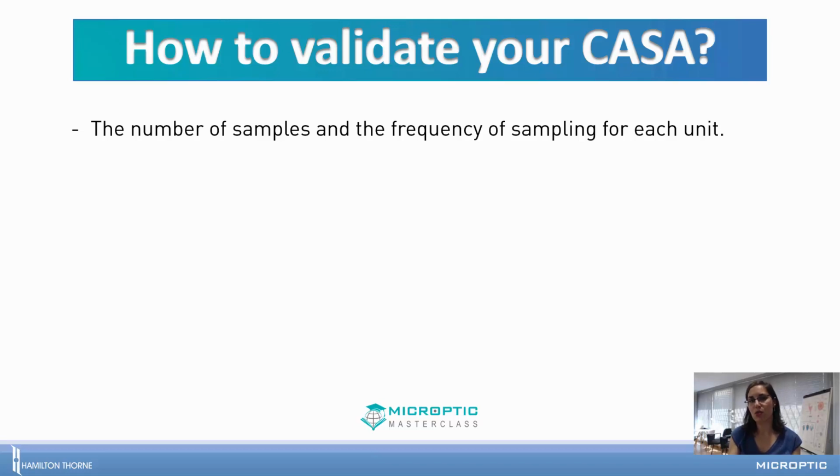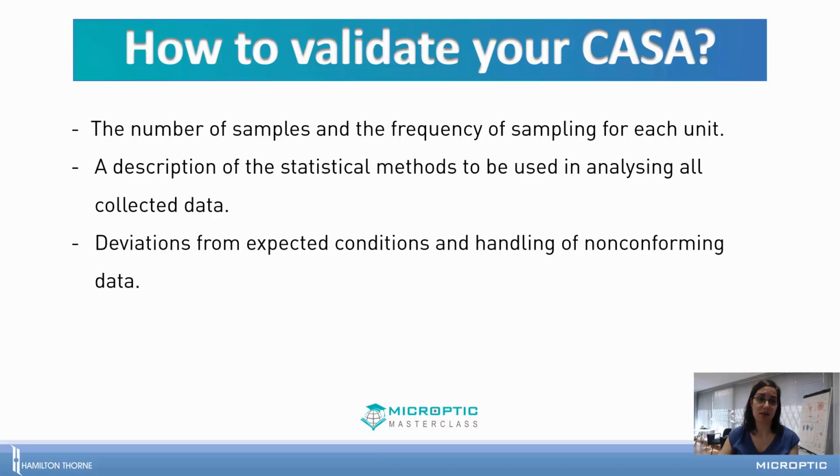Here what we need to consider is that we are reaching the minimum number of degrees of freedom to do robust statistics, to get significant statistics. So it's important to keep in mind, if you want to make groups or subgroups, what is the minimum number of samples to be included in each group or subgroup, and whether you are reaching the minimum number of degrees of freedom in order to get good statistics.